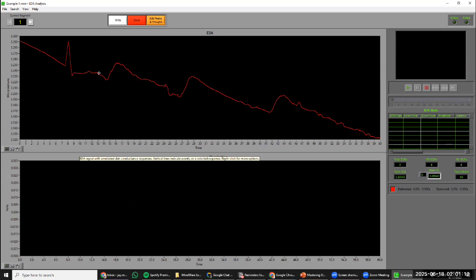So in these cases, this can be indicative of motion artifact, which is likely this first triangle wave, and then just not having great connectivity with the sensors. So this could be you didn't have them wash their hands before you put them on, or the sensors are dried out. Things like that can make this line a little bit more jagged. It can also be the case that it's just auto scaling, and this is likely what's occurring here.